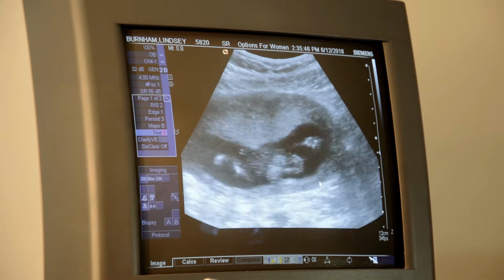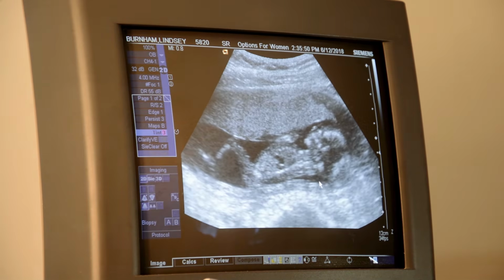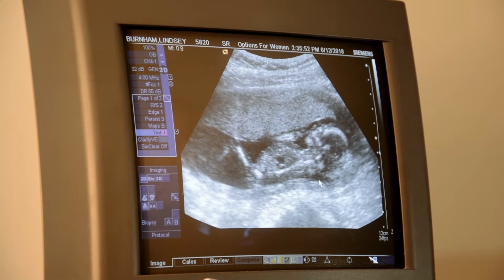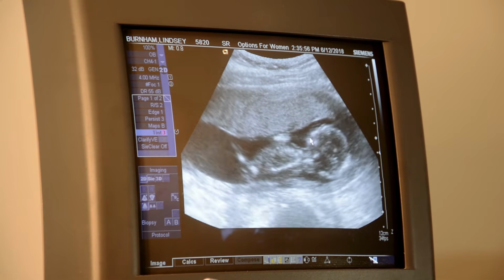Go ahead and talk through the baby. Okay, take your ear. Oh my gosh. Hands going up to the mouth. It looks like he's putting his hand up to his mouth. Oh, that's so cute.